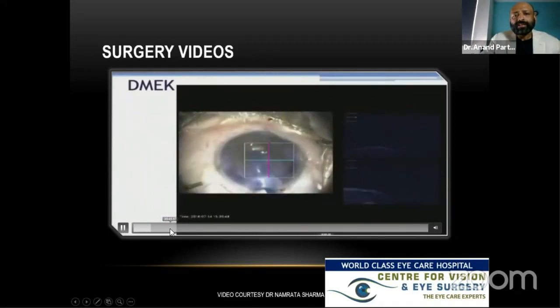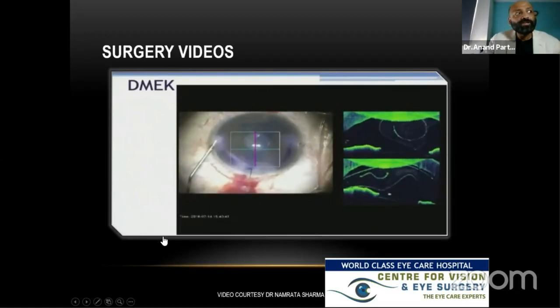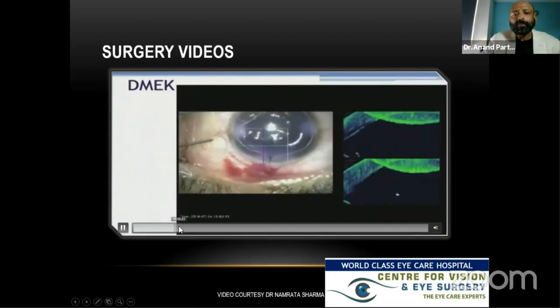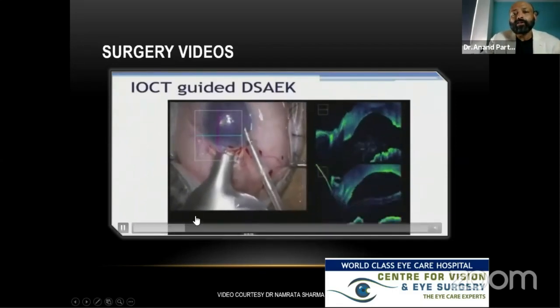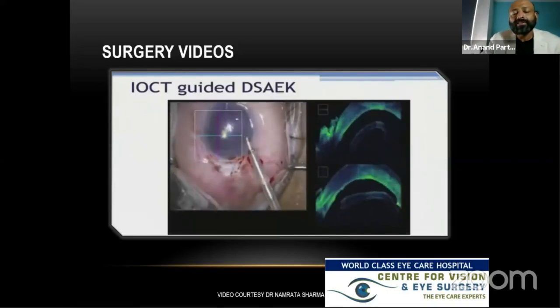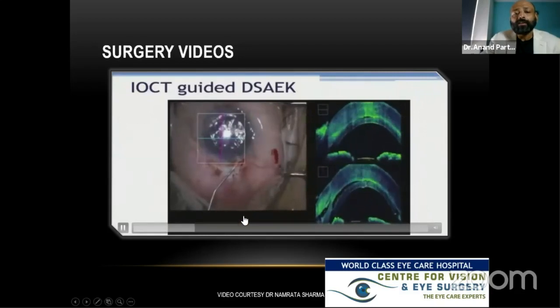And once you inject it, and probably in DMEK, the application of the intraoperative OCT has been quite significant, just to show the scrolls which show the orientation of the corneas. Now, this is also important, especially in DMEK, assisted for DSEK as well, to make sure that you remove the water clefts across the position once you insert the graft, because we feel that on anterior chamber, when you visualize it, and if you have slightly bad corneas where you do not have good visualization, you can make out these water clefts which need to be eliminated.